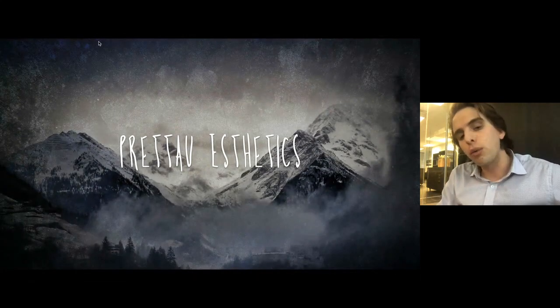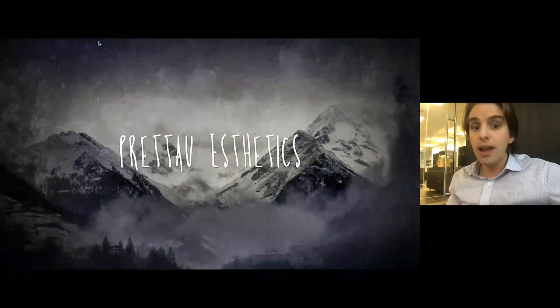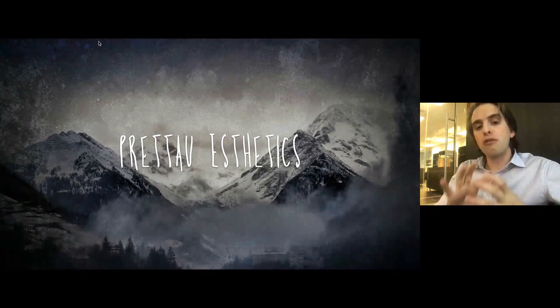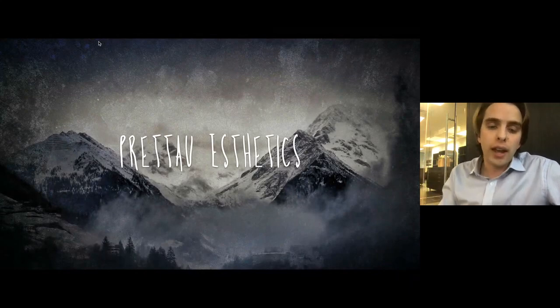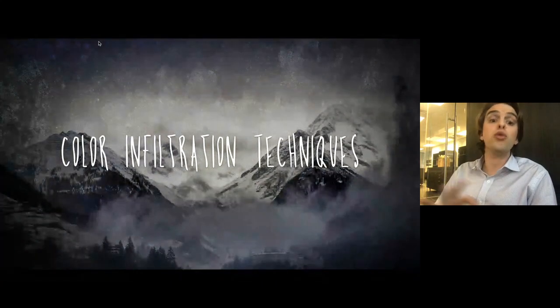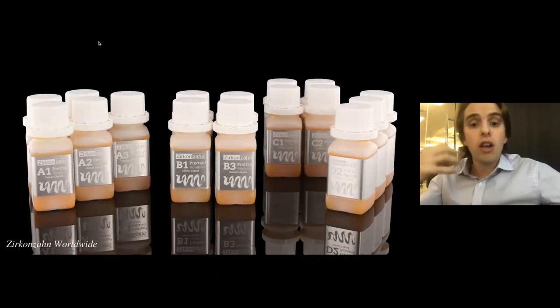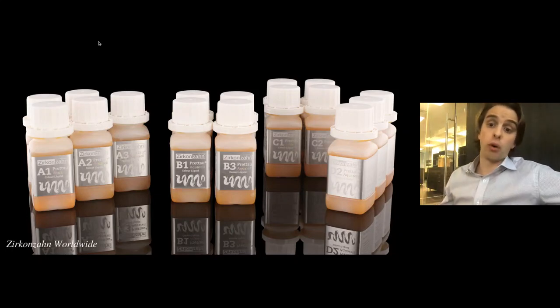So in your first training, we will also cover some principles of zirconia aesthetics, okay? And we're not going to start off with some big full mouth reconstruction. No, we're going to start very, very small and focus on the concepts that will drive us when we go to create full mouth rehabilitations. And so the first step in the zirconia post-processing, once we've removed the structure from our blank, is the color infiltration technique. So this means that we need to start to understand the different color liquids that we have in our bag of tricks and in our toolbox, because each color liquid relates to a specific zirconia.